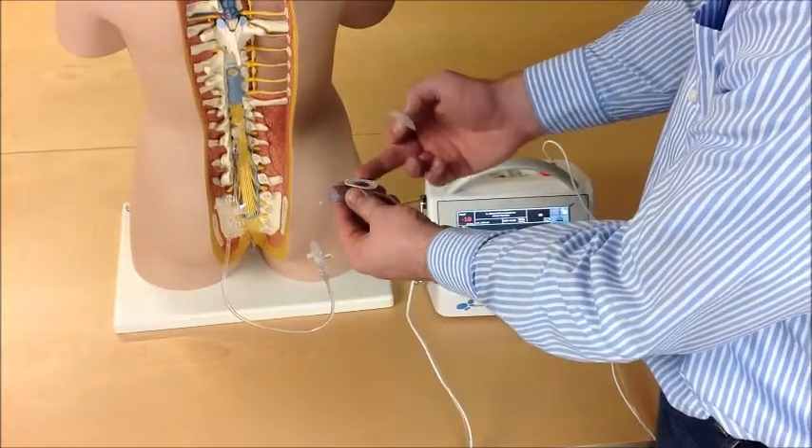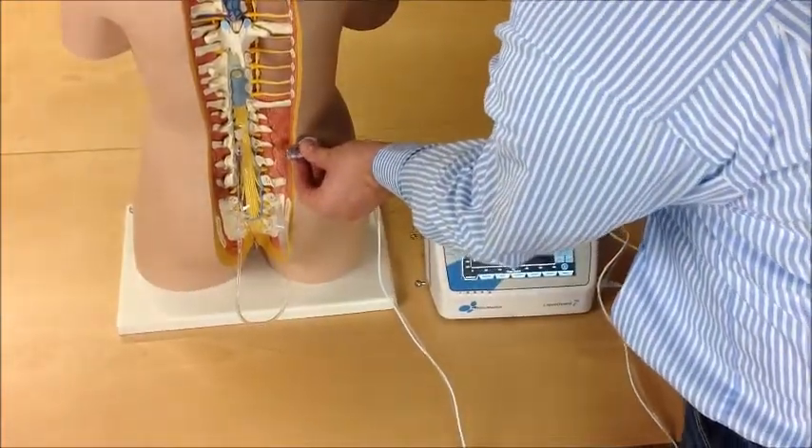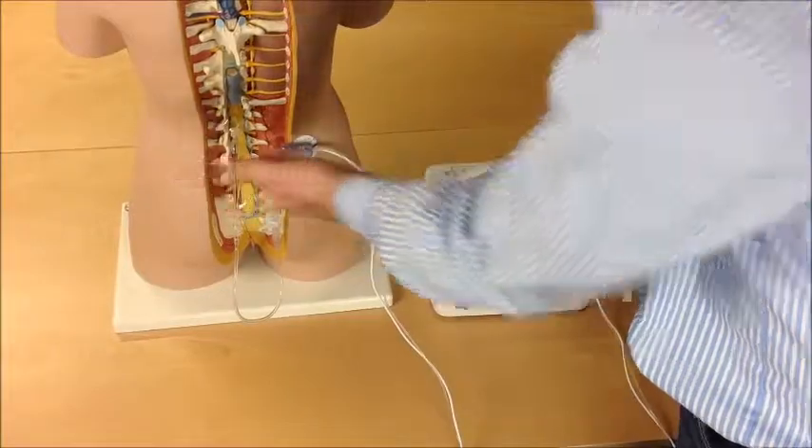Connect the pressure sensor housing to the patient at the height where you prick the patient.